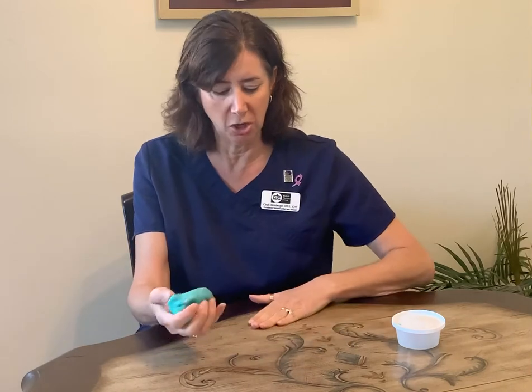Second important thing is you need to use the putty on a hard, non-porous surface. Do not put it on fabric at all. Tablecloths, your clothing, it will stick and pretty much never comes off. So make sure you do it on a hard surface. So I'm going to show you a few exercises, my few favorites.